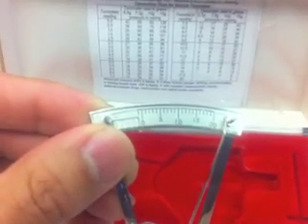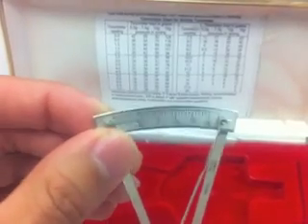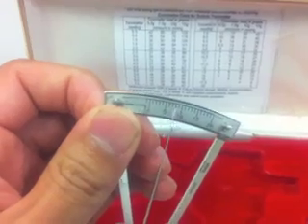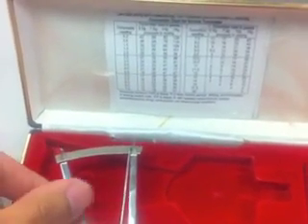If we pick up the tonometer and take a look at it, you can see that on the top here we have the grading scales from 0 to 20. And when you get a measurement, the needle should point to one of these numbers. Then, depending on which weight you have, we'll go to the scale and find out what the exact intraocular pressure is.